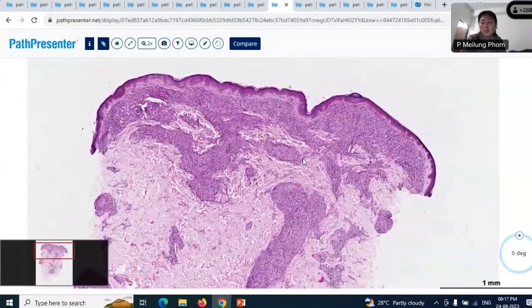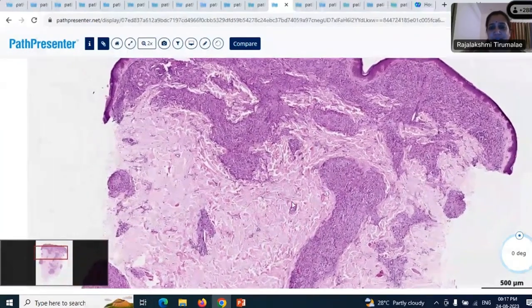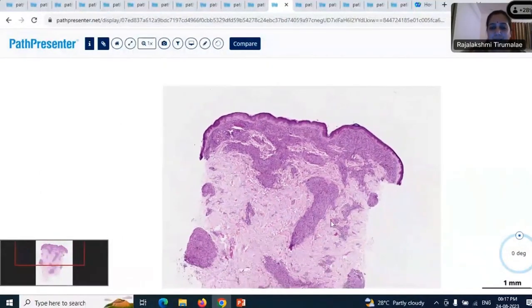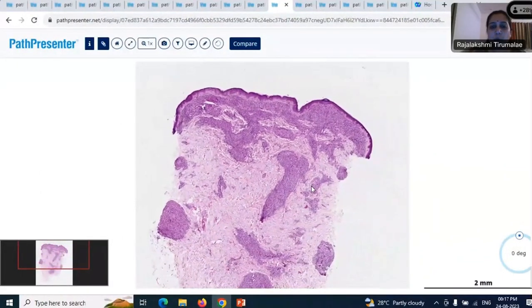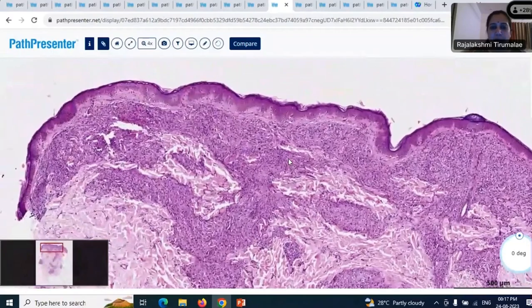Can you tell me what is the term used to refer to this pattern? It is a nodular infiltrate. It's in a curvilinear pattern, isn't it? So these are oblong or curvilinear. So there's a classical curvilinear pattern. And yeah, now go ahead.